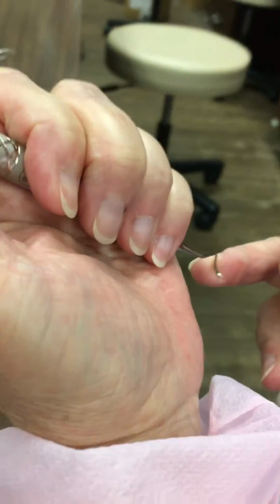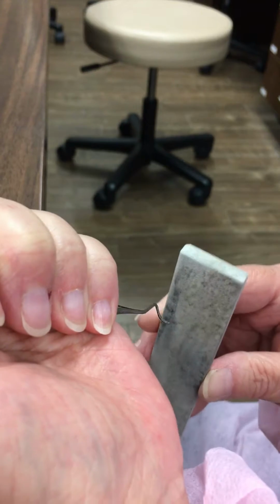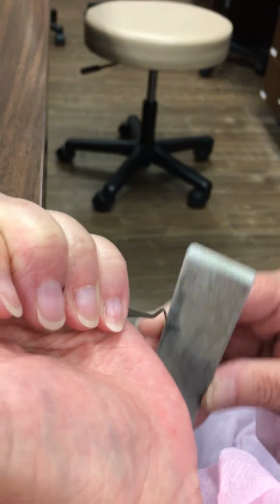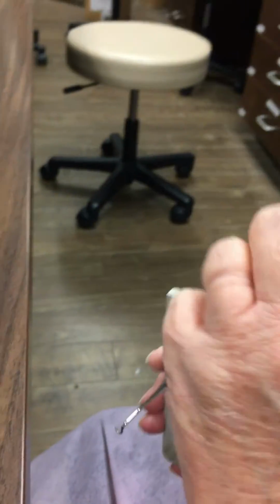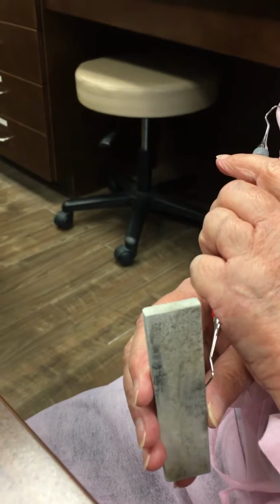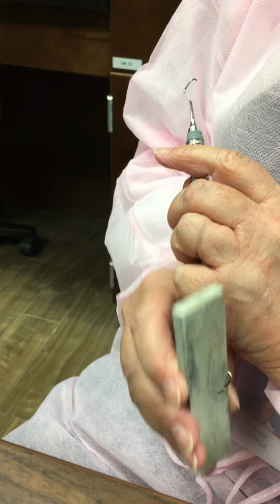I'm going to look for the lower third of the shank. I've got my toe toward me. 90, 110. All right, now I'm going to turn my toe in the opposite direction, so now my handle is going in the opposite direction, and my lower third of the shank will be parallel to my stone or perpendicular to the floor. 90, 110.